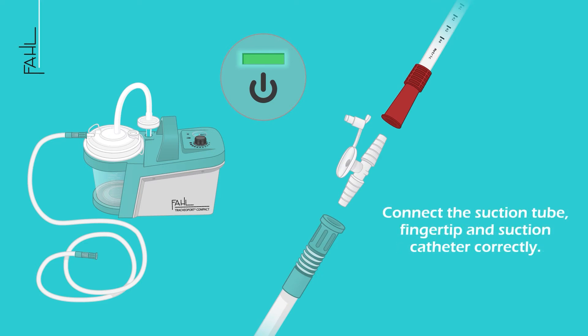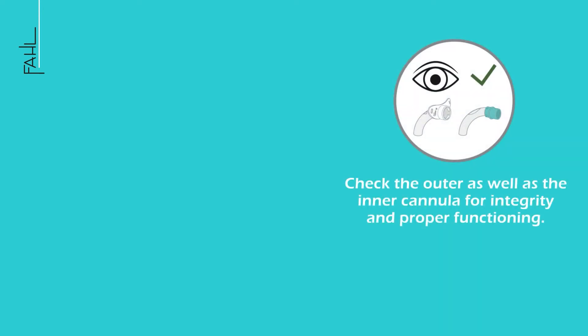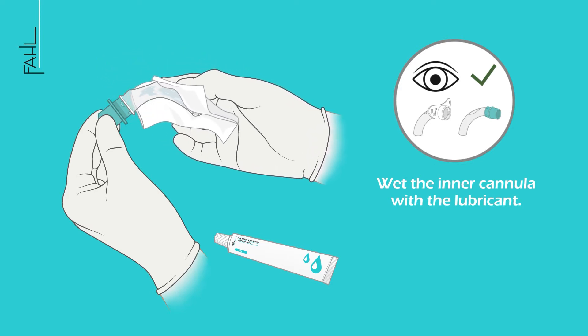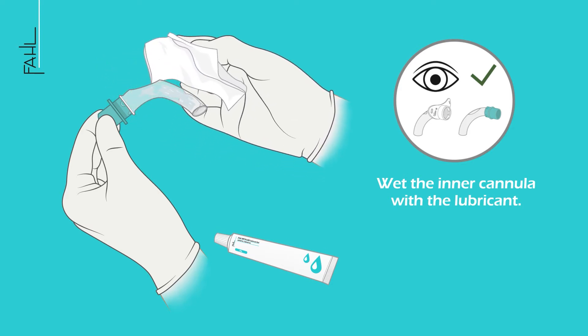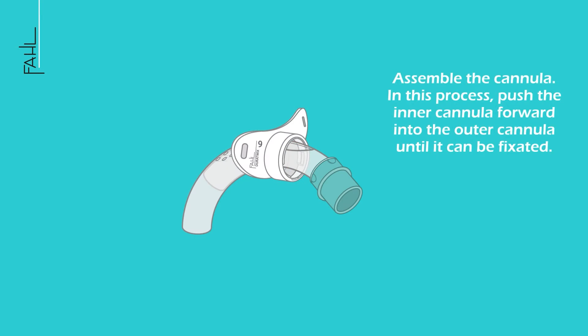Connect the suction tube, fingertip, and suction catheter correctly. Check the outer as well as the inner cannula for integrity and proper functioning. Wet the inner cannula with the lubricant.